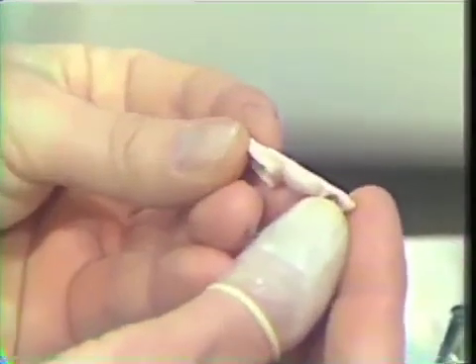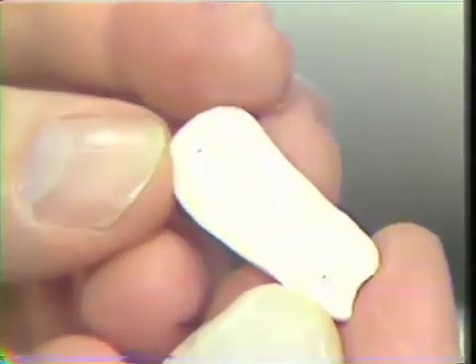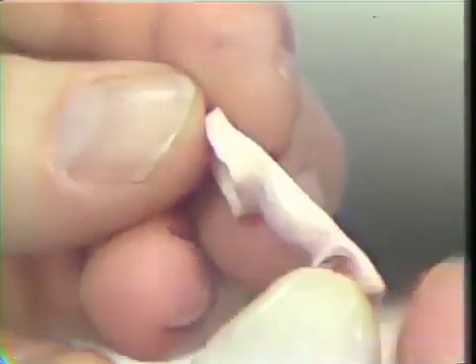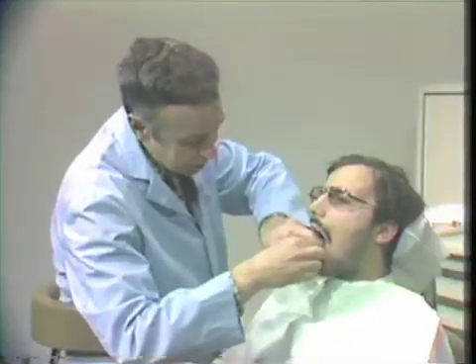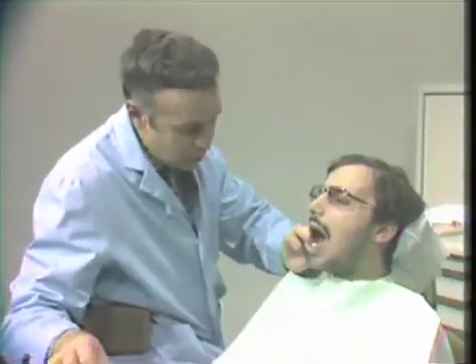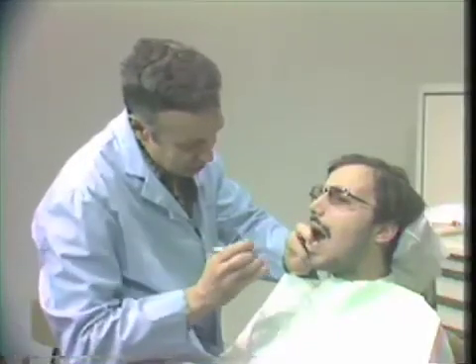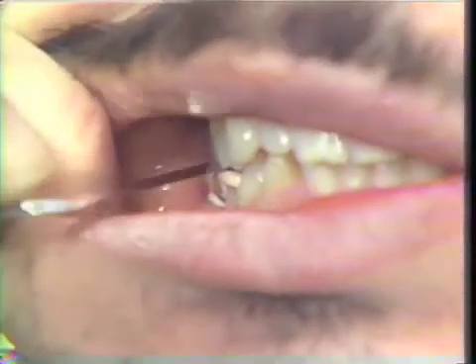The next step in the procedure is to trim the base so that we do have clearance between the opposing dentition and the platform, and then we will apply the wax. But now it will be necessary, after we have trimmed it, to try it back into the oral cavity and check to be sure that we do not have any contacts on the opposing dentition. So again, using our shim stock, would you close together please, we will check to make sure that we do have clearance, and as you can see we do have clearance on the platform.